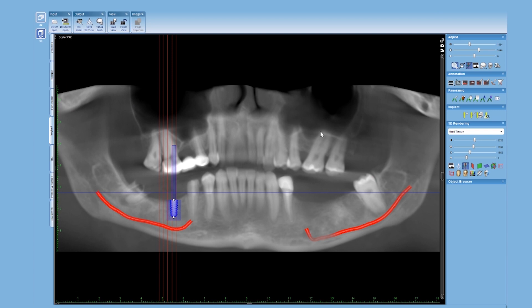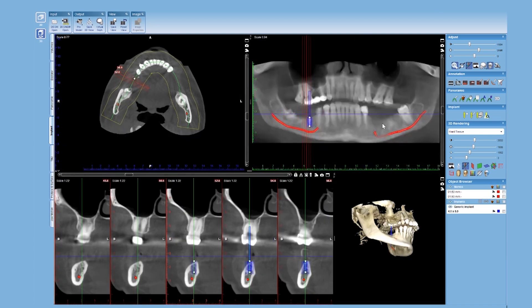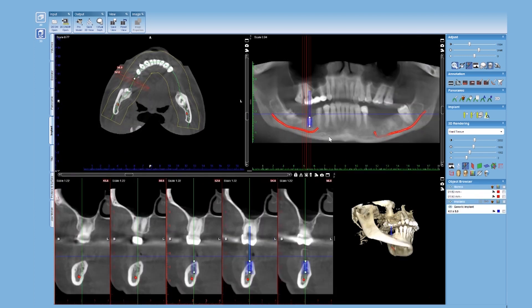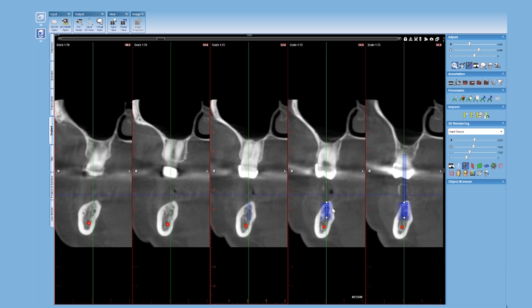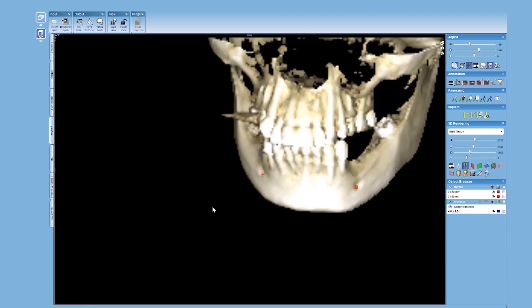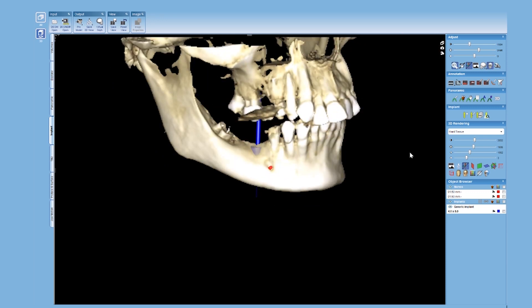We can see how the implant appears to be placed, but let's check it in cut section to confirm. In the cut section, we can see the implant threads are exposed, so we go back to our original file and slightly adjust the position. Coming back to the cut section, those threads are now embedded inside — but the angle is not most favorable. We correct the angle, bodily move the implant, and there we are in a perfect position virtually. This virtual position is then checked on a 3D mandible, where we can see it is completely encased in bone despite the compromised bone situation.